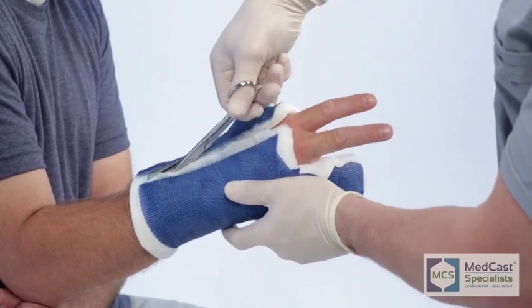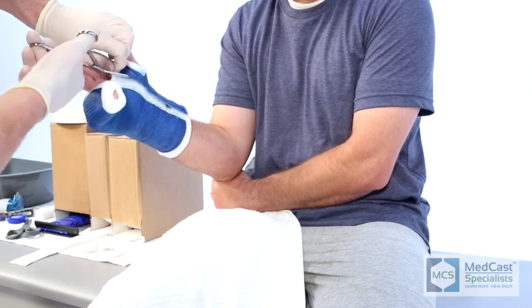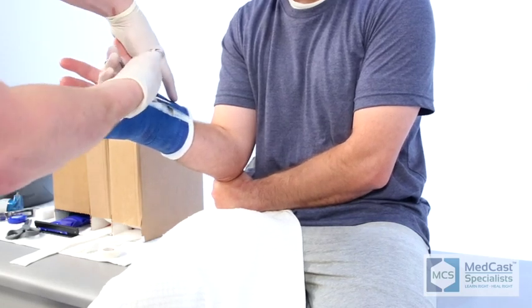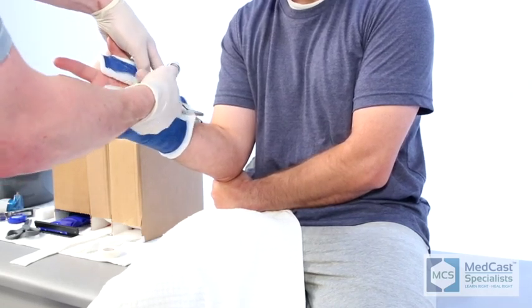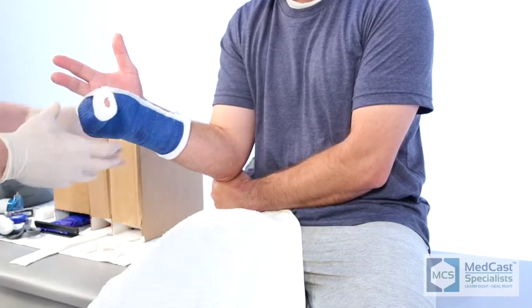Keep in mind the injury the patient has. If they've had any type of surgery where they may have pins in the digits or metacarpals, you want to be cautious as you're pulling the cast off — don't just yank it off. The patient will certainly let you know if they've got pins in there. It's good practice to know the injury you're casting for when it comes to cast removal.